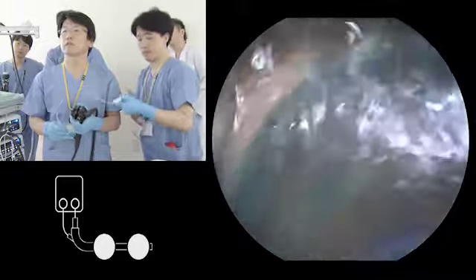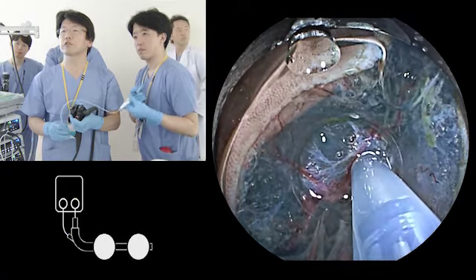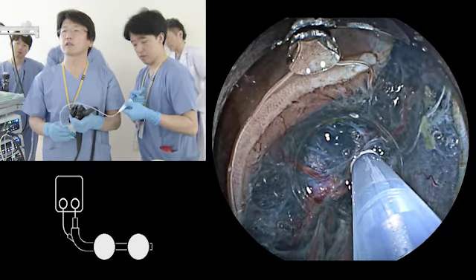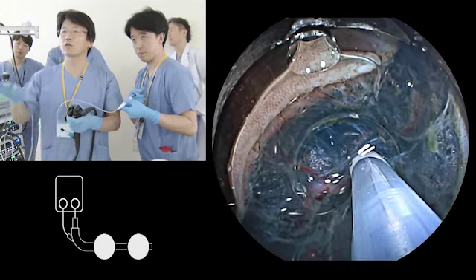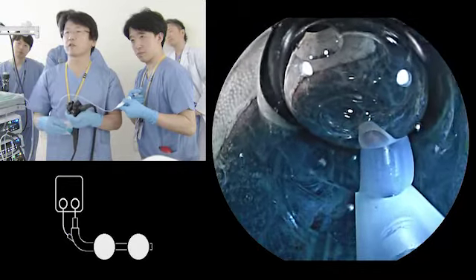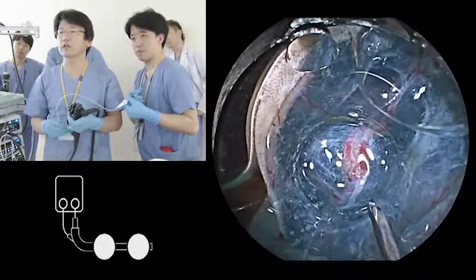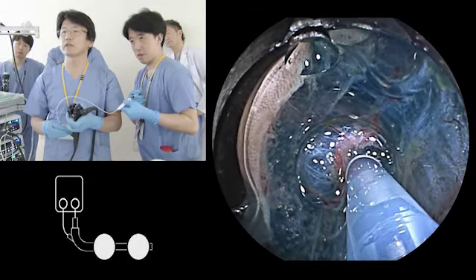Okay. I think the submucosal tissue above the muscle layer is finer than the tissue below the mucosa. So sometimes there is a lot of fat tissue and blood vessels, everything goes up and just clear submucosal tissue is on the muscle layer. Yeah. Okay, inject.